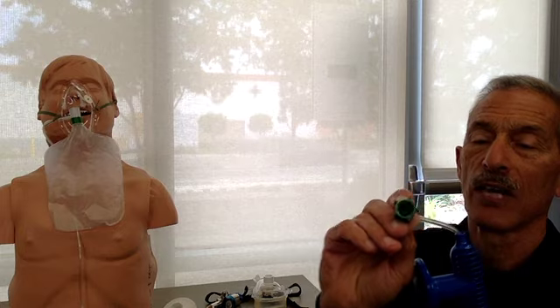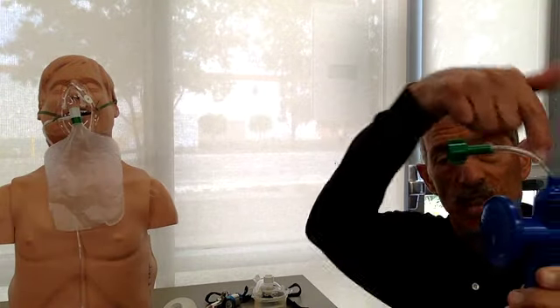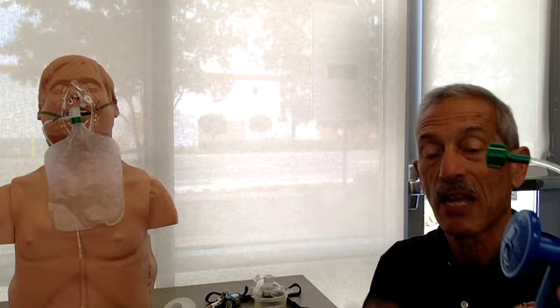There's a little cap here. It's threaded, and it threads onto that high pressure nipple on the side of your regulator on your oxygen tank. And once you thread this all the way on, it automatically starts flowing at about 50 liters per minute, pretty high pressure. It goes down the tubing, and this is an oxygen generator device. What it does is it sucks air in from the outside world. It mixes the oxygen with ambient air, and it increases the volume and pressure through the tubing.